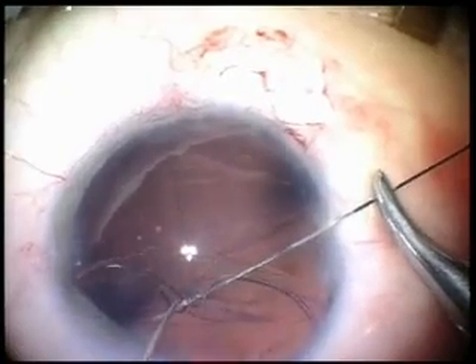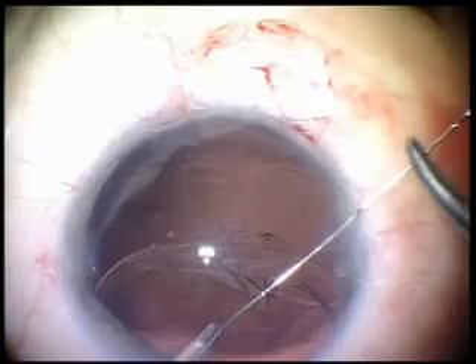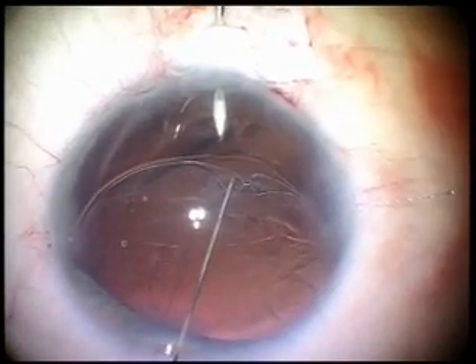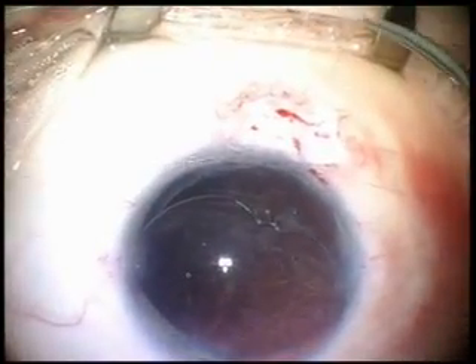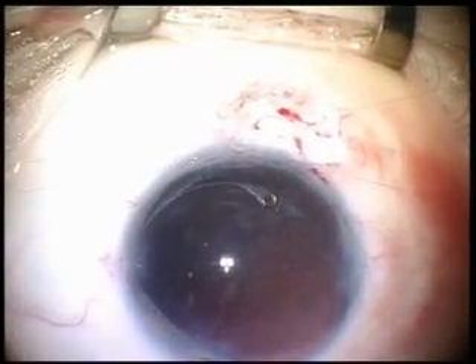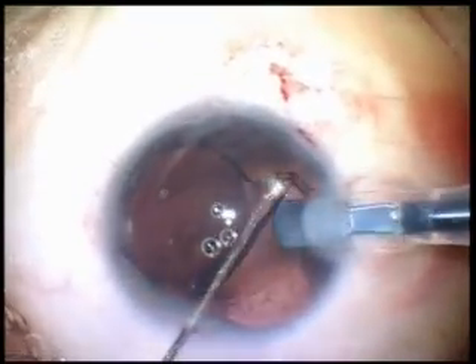The surgeon can use both ring eyelets for scleral suture fixation. The suture goes out of the capsular bag through the capsulorhexis opening into the ciliary sulcus. After scleral suturing, the central position of the capsular bag is achieved, and the intraocular lens can be implanted into the capsular bag safely.